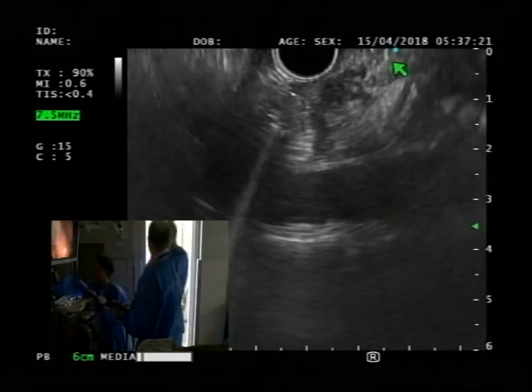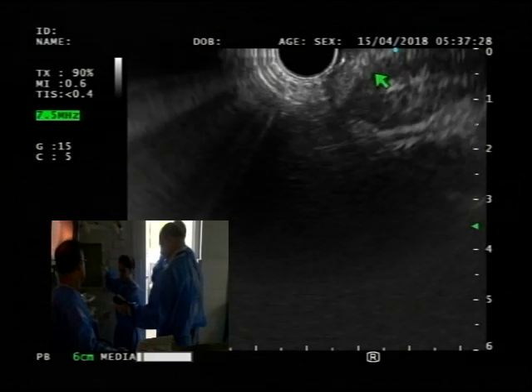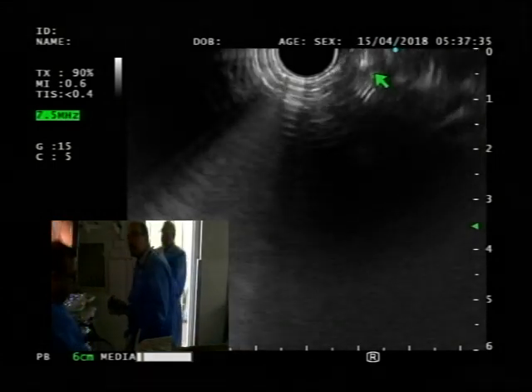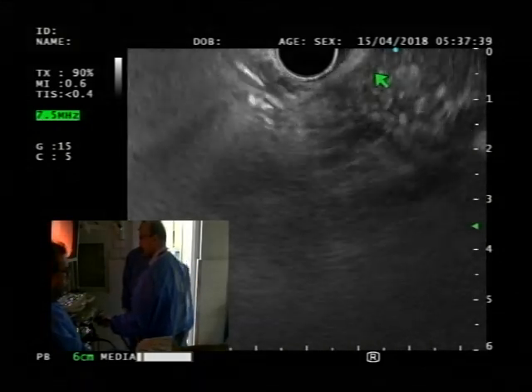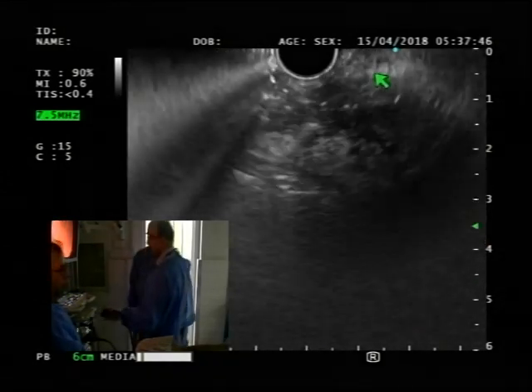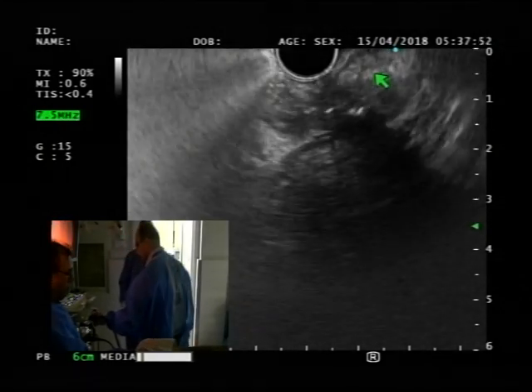I did do two different planes, but I took the needle out all the way. So yeah, I want you to try and do this. Just don't worry about the endo image. Get here, and it's just loose movements. All you're doing is spinning. Thumb is not too far down in this position. So try and maintain the scope position, and do that.